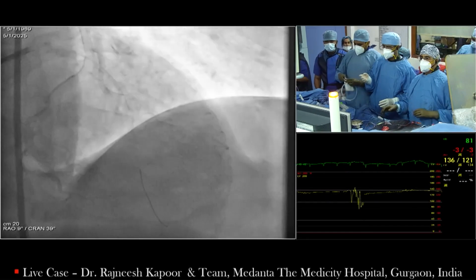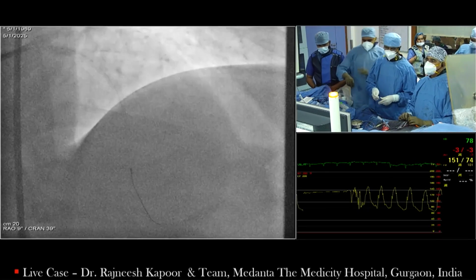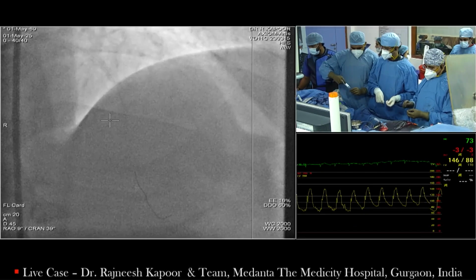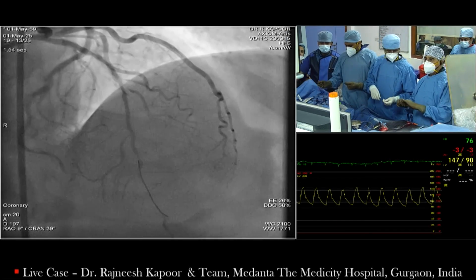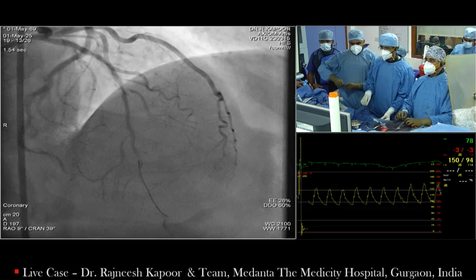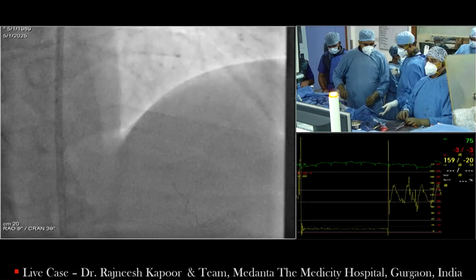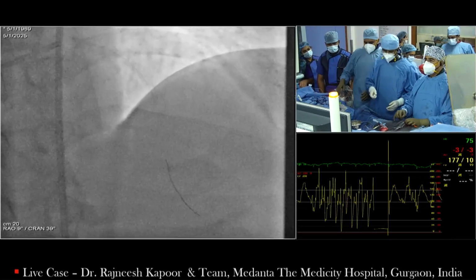Did you stay inflated with the balloon more than a second? We saw you balloon the whole vessel very, very fast. Okay, so I'm going with the 2.5 balloon now and dilating the whole segment again. We need to have a wire down. Have some nitro. The vessel looks quite good. These are NC balloons? Yeah, these are all NC balloons.